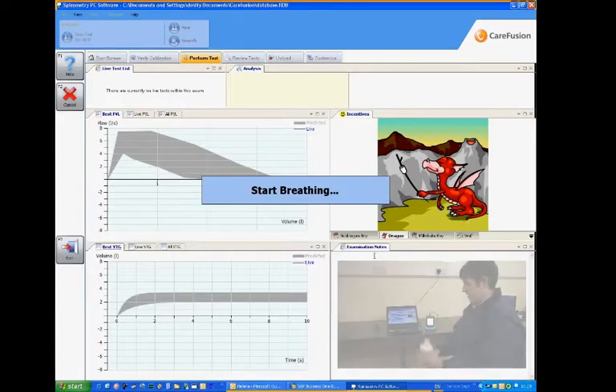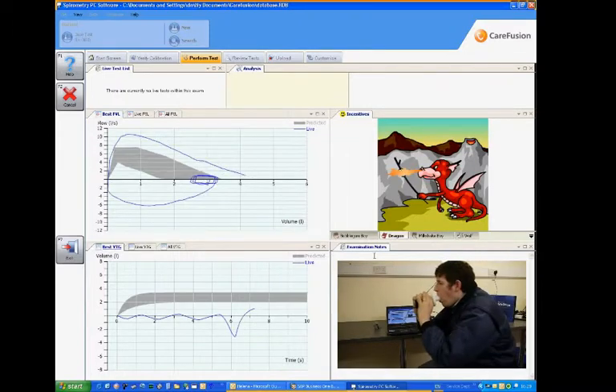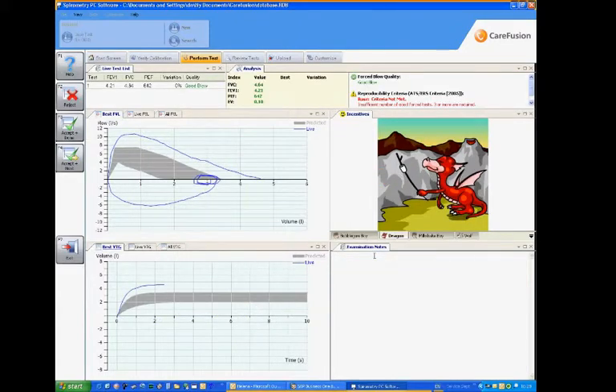So if we now look at an example, we can actually see where the measurement is taking place, and in this case a full inspiration and expiration is being completed. So this is just one test on the unit, and obviously then we can select accept and done. Now a number of measurements should be taken, but in this case we've just done one.